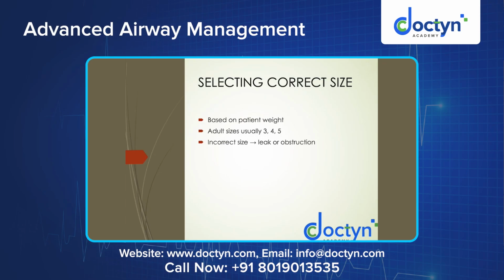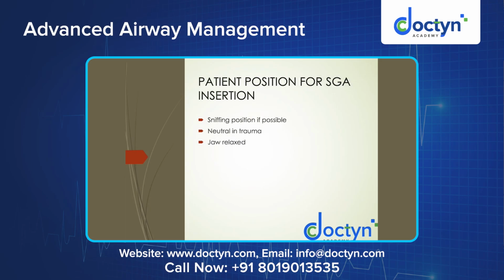Usually while you're opening a supraglottic airway, the packaging will clearly mention what age, height, or weight of the patient this is the right mask for. The position is usually the sniffing position if possible, but it is not compulsory that you always put it in a sniffing position. Use neutral position in a trauma patient, as there is a risk of cervical spine injury.